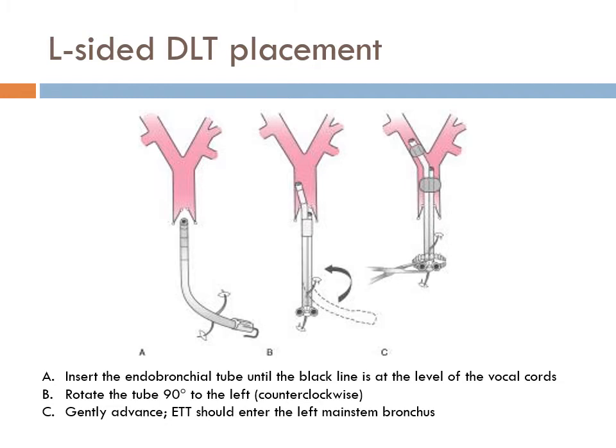So now you're sitting just past the cords, facing up, and now you have two choices. One, ventilate, and just take your time. So which cuff do I put up? Blue or white? Blue is bronchial, white is tracheal. Tracheal, right? So I put the tracheal cuff up, ventilate, and get ready.